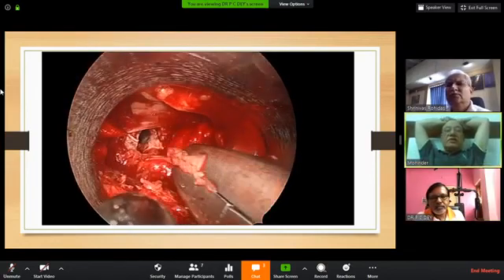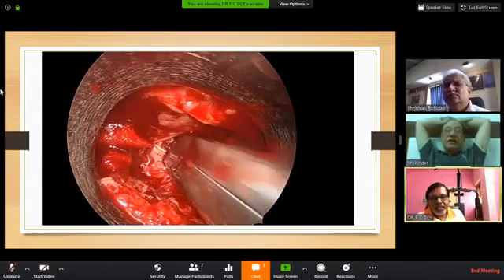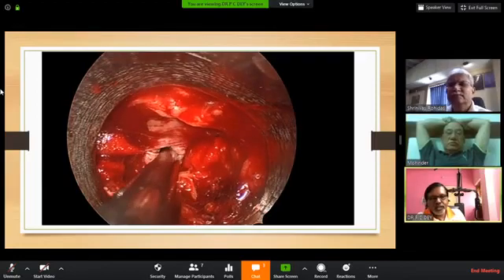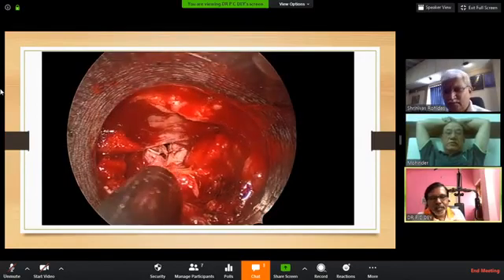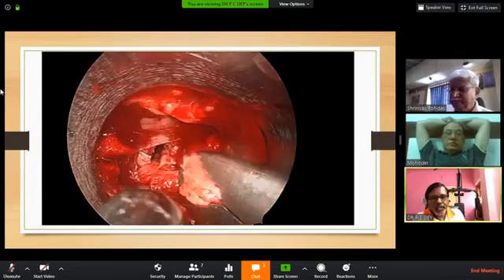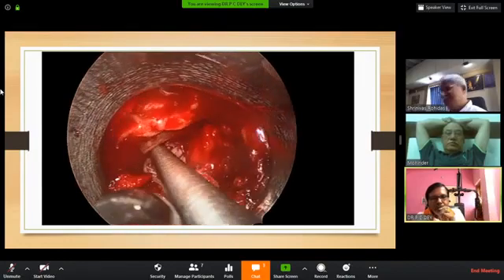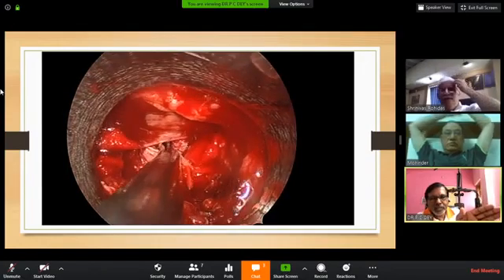Bleeding will be there. Now I can see your operative field is absolutely dry, and you are very comfortable. Either there was some epidural vein injury which was bleeding and you controlled it by pressure or packing. In between, I use the bipolar to coagulate that, which helps a little bit. Also when I give a patty cranially and caudally, that compresses the epidural veins, and after that it sometimes automatically reduces the bleeding. We have marked that I have given a crisscross incision to the annulus.